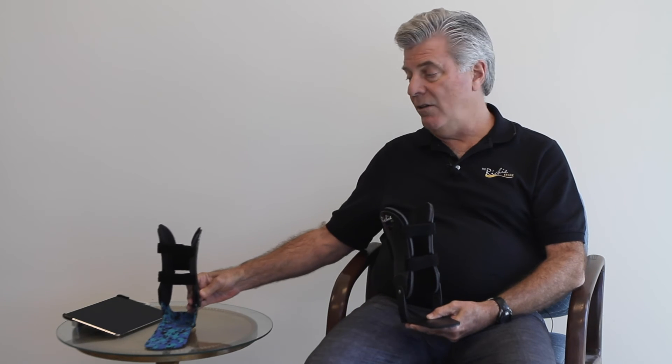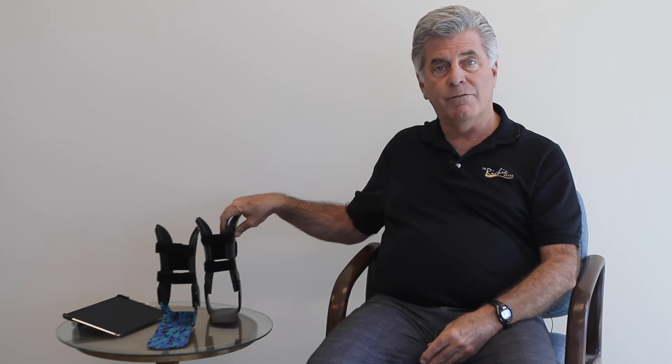And to make things easier, we've provided several teaching videos on how to perform very simple in-office adjustments of the Ritchie brace, to avoid the obstacle of having to send the brace back to the lab.